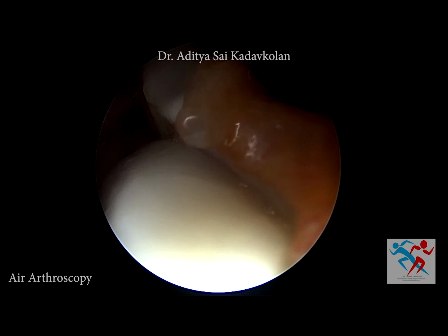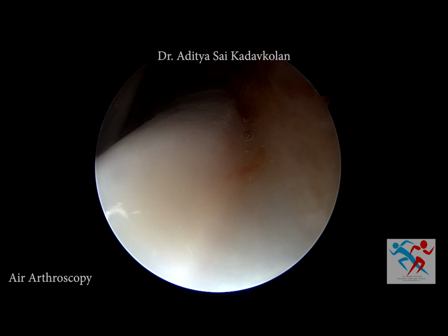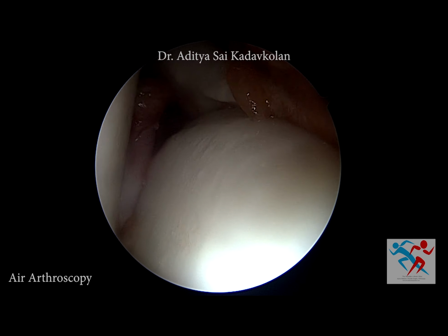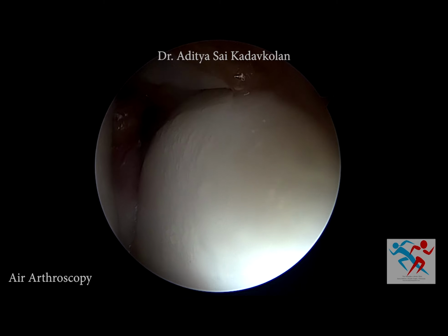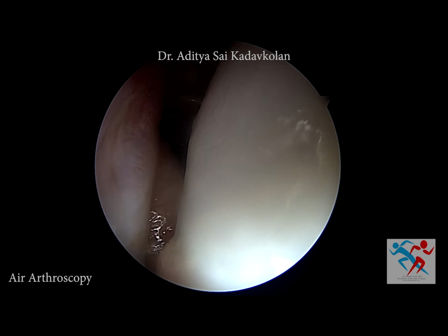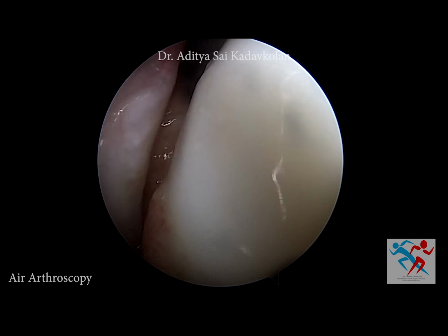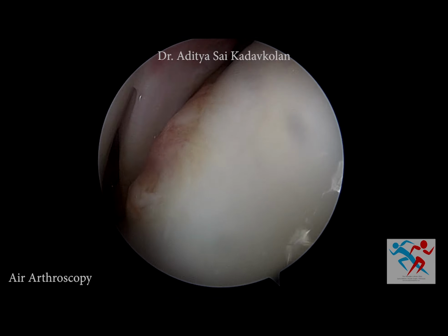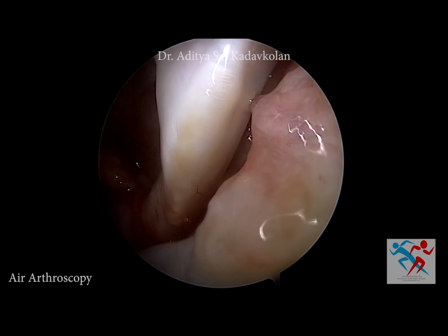Hi, I'm showing a diagnostic arthroscopy. So this is inside your shoulder joint. On the right you can see the socket and on the left side is the ball. Now what you can see here is around this ball and socket are the ligaments that hold the joint together. There is a loose body there which you could see like that tiny dot.